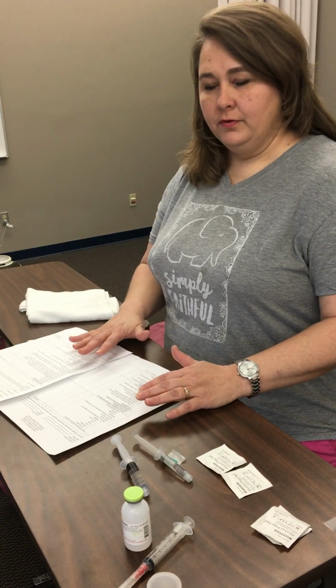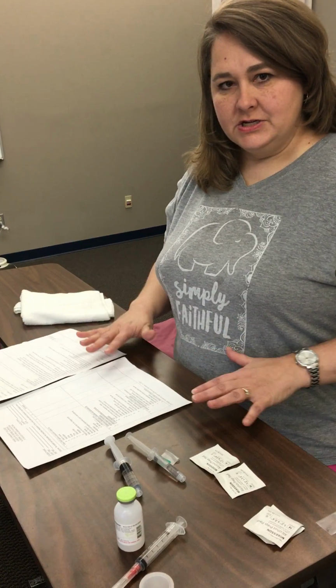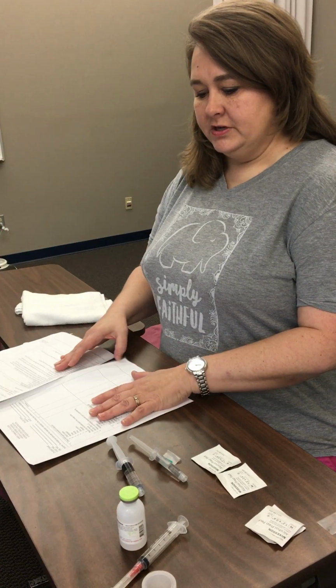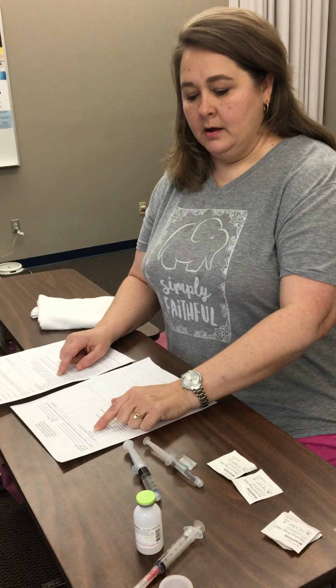I'm going to start off with the MAR. This is my nurse's station, and then I'll move to the bedside in just a moment. First of all, I want to check my MAR against my doctor's orders to be sure that I have what the doctor has ordered for this client.